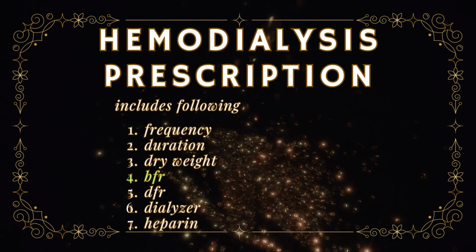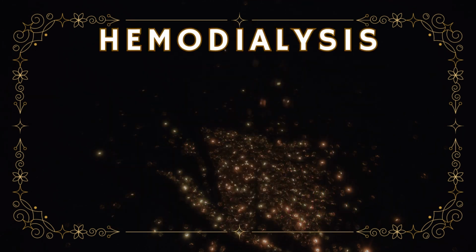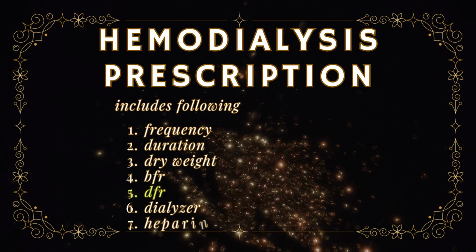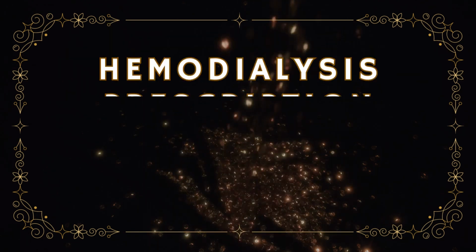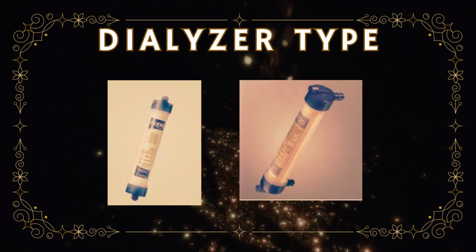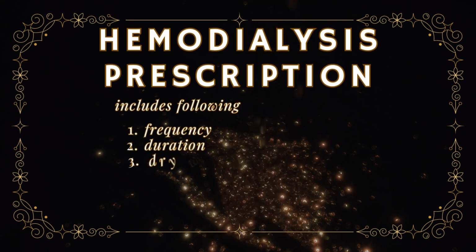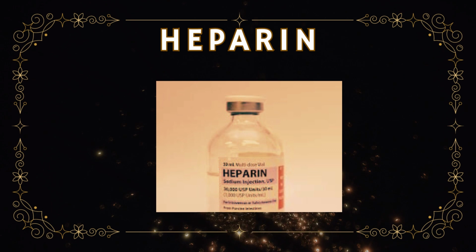BFR is blood flow rate, which is the pump flow rate at which blood is being pulled from the body. DFR is the dialysate flow rate, the rate at which dialysate goes to the dialyzer. Then is the dialyzer type, which could be low flux or high flux dialyzer. Lastly, there would be heparin, which is given as a bolus at the start of dialysis and then continuously per hour of dialysis.